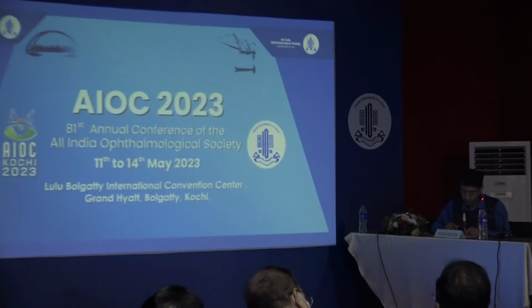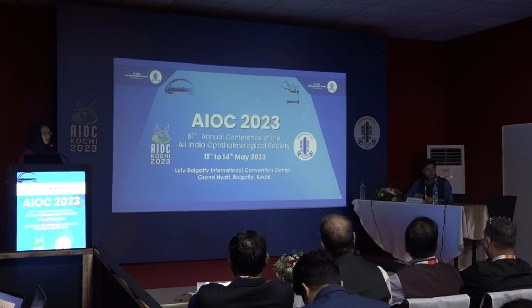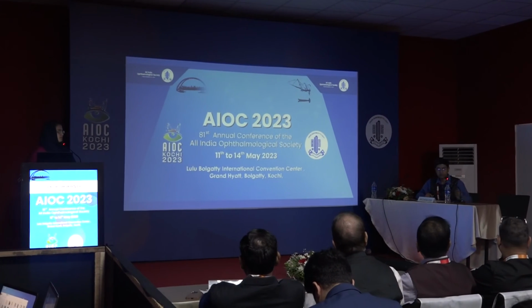With that machine, with that metal cannula, we can attach pediatric feeding tubes, number 6, number 4. Those are very fine, and that can be done with simply available suction machines also. But definitely this is good. If we can get it for 1,000 rupees, it is definitely a cheaper version. Thank you.